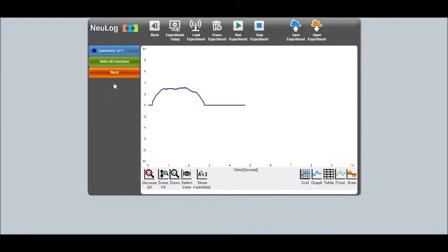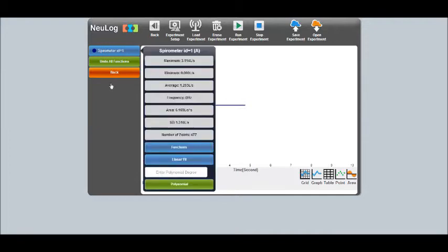First, click on Show Functions, then select the spirometer sensor icon on the left side of the screen. We see several functions, but the one we are looking for is Area. The area calculation gives us the area under the curve, which is the total lung capacity.